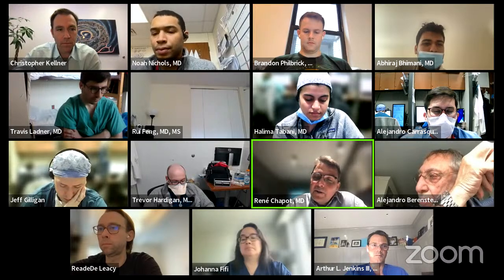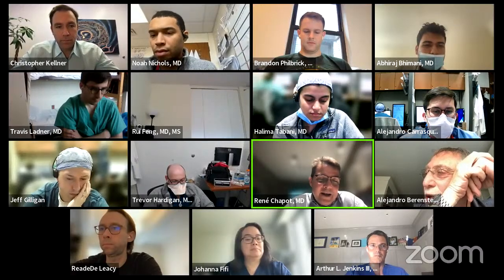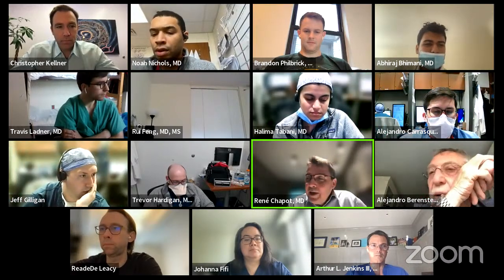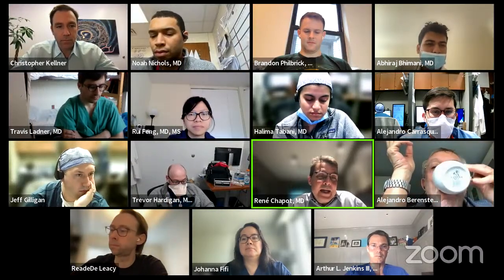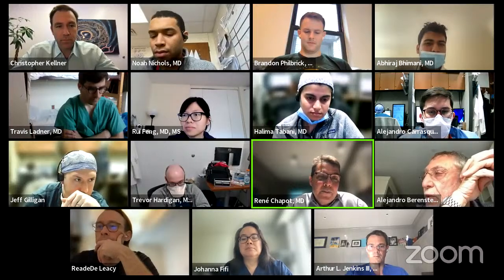I tried to show it on some pictures on MR. If you have no lesions on DWI imaging, then there is no arterial ischemia. And we all know that venous ischemia is reversible. Just look at patients having extensive sinus thrombosis. They're doing very poorly, and at some point they do very well, because this edema is reversible. And I think that we use the same principle when we go by the veins.